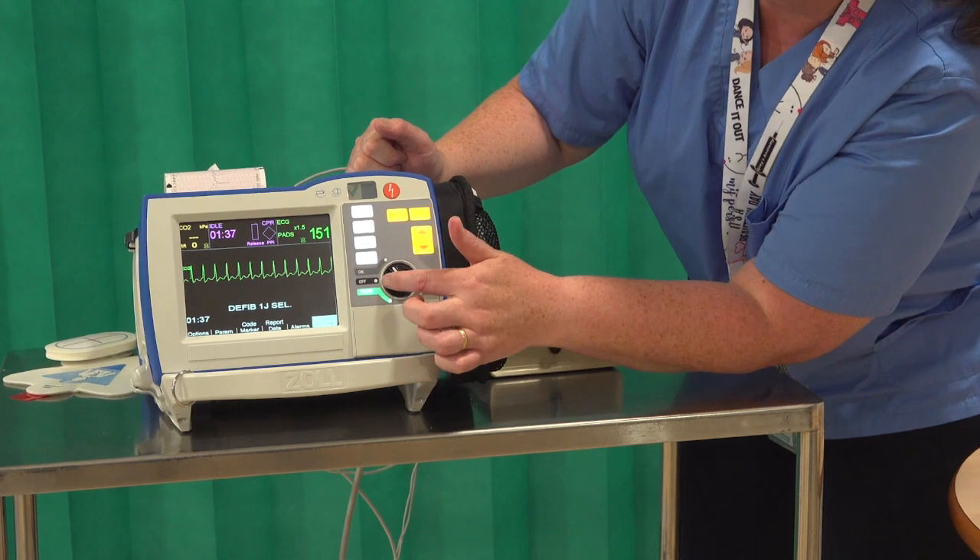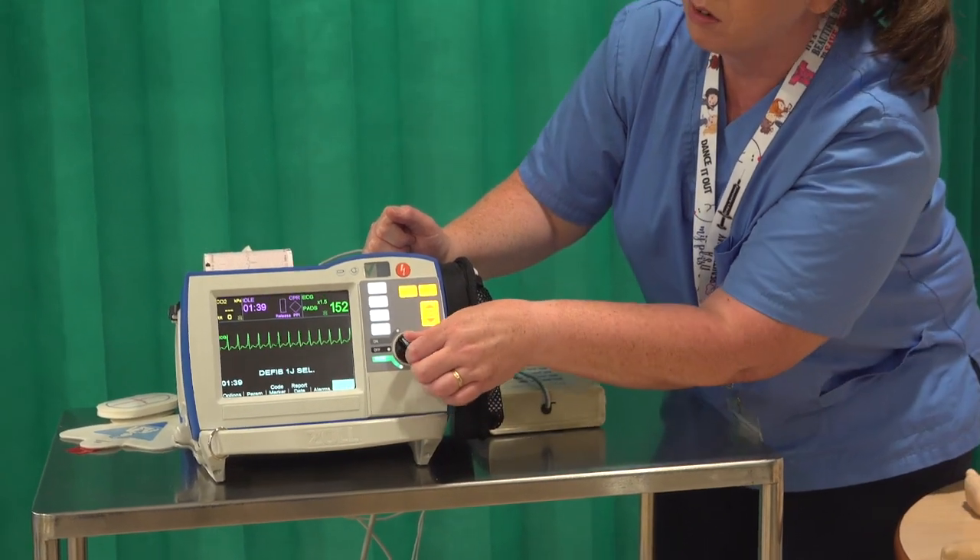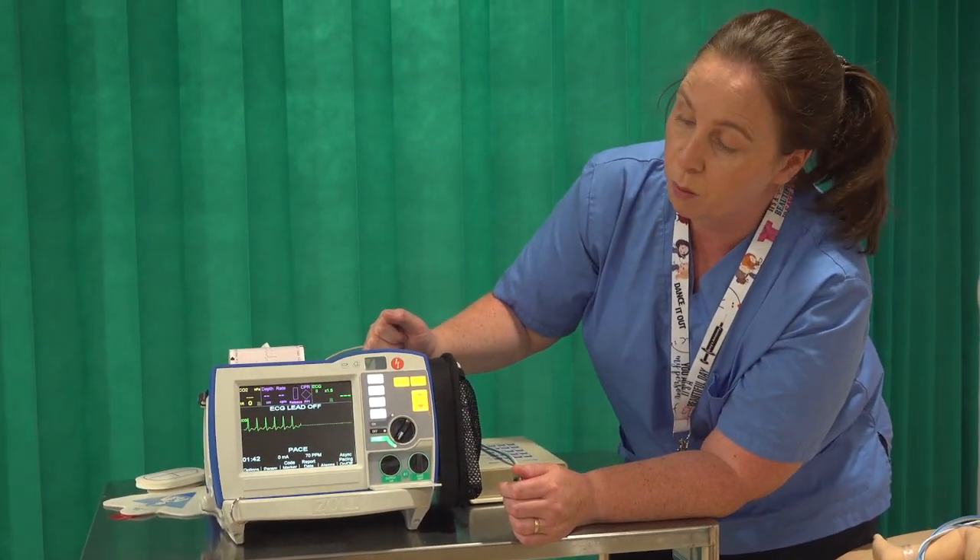Some machines also have the option of pacing. Bringing that around opens the pacing function should it be required.